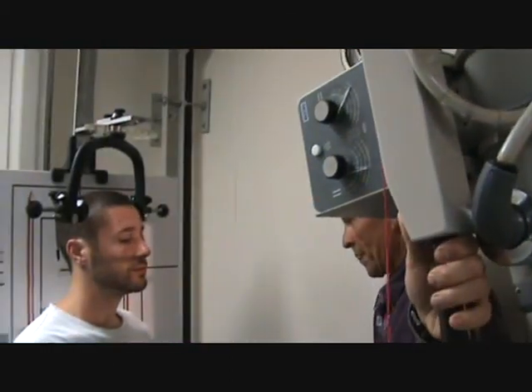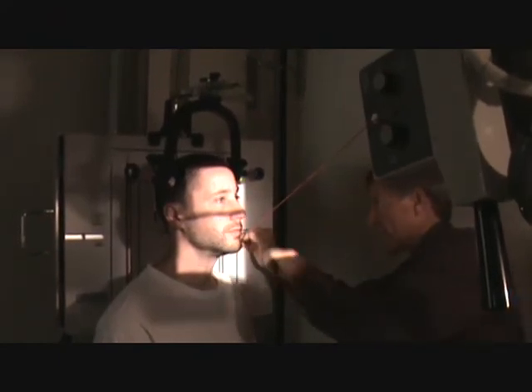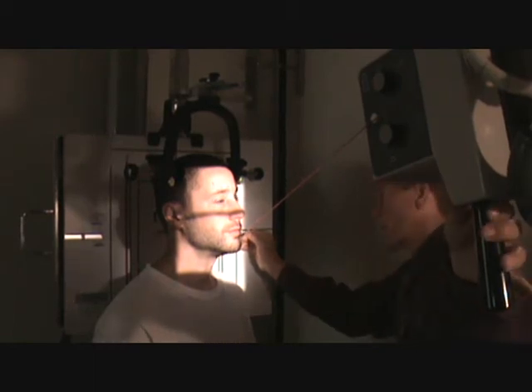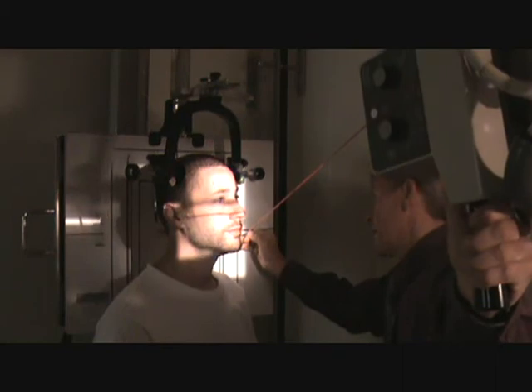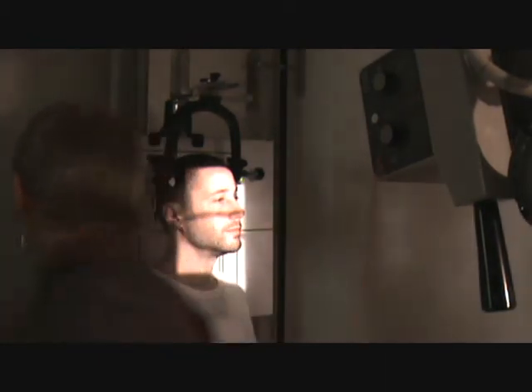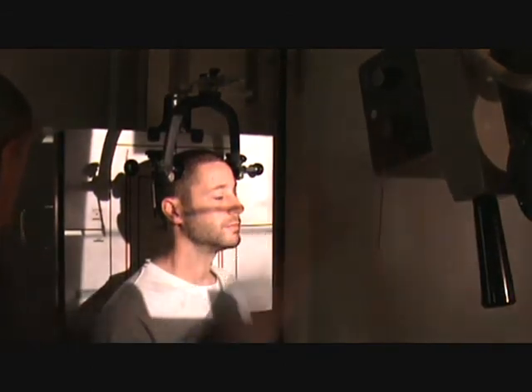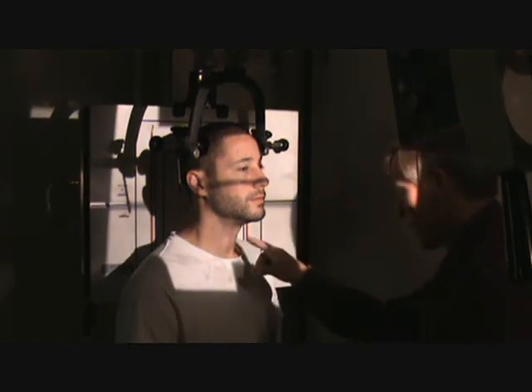I'm ready to bring the tube in. I'll look at my string and make it pass through the middle of the maxillary sinus and the TP on the other side at eye level, then raise or lower accordingly — it's matching up fine. To demonstrate the technique: I line up the string first, then make the horizontal crosshair match my string — that seems to be the more accurate way. If I open up my collimation, I can see I'm hitting my bucky a little bit low, so I'll raise or lower my bucky just a little. Horizontal crosshair going through the middle of the maxillary sinus.